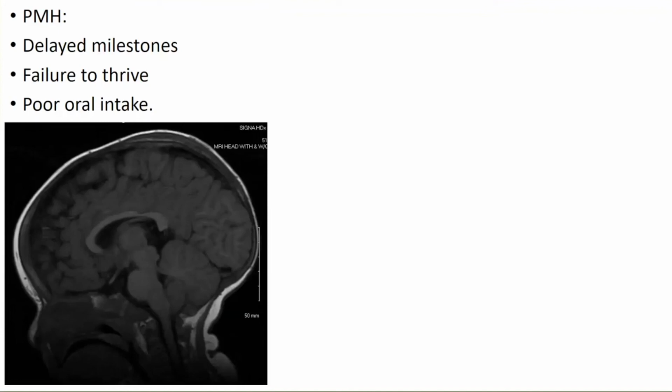Okay. For some reason, I just cannot see this one as well on my computer. At least from what I can see, it looks like the craniocervical junction looks normal. Okay. So that's good. So Paul, maybe we'll pick on you. So you have a new scan when she's 12 years of age that shows tonsillar ectopia and maybe ventriculomegaly. That's a little odd. But when you look at the older scan, there's no evidence of tonsillar ectopia. How do you reconcile that?